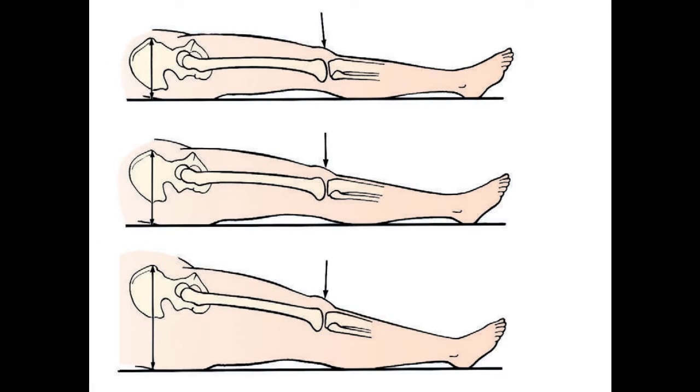At less than 19 centimeters, it is 3 to 5 degrees caudad for a thin pelvis. A thickness of 19 to 24 centimeters is equal to a 0 degree central ray. But with greater than 24 centimeters, 3 to 5 degrees cephalad is applied.